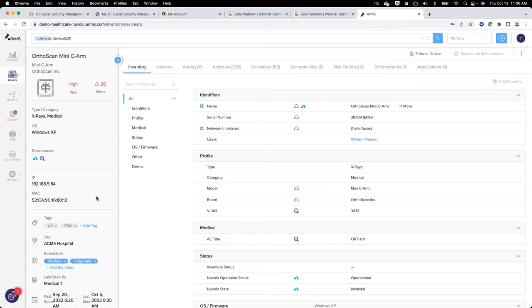Just a follow up to that. Mm-hmm. So thank you for that. We might not look at this information all the time on a daily basis, but with there being a reporting feature, and when that reporting feature comes from Armis or Nuvolo, where once a month or every 6 months we run a report that says, of all the things you've inventoried over the last 6 months, these are the risks that Armis has discovered, and you can go forward addressing it with this IoT environment.